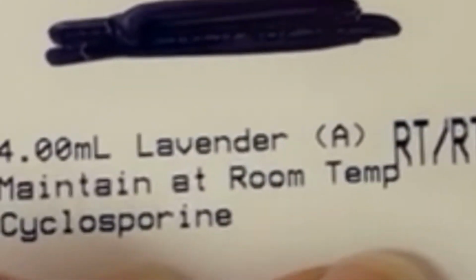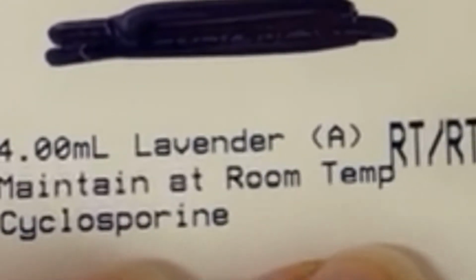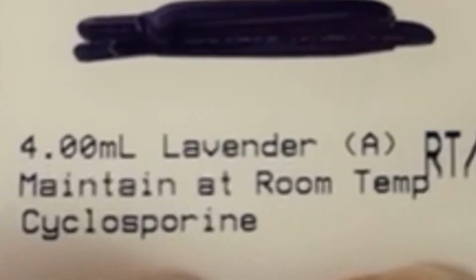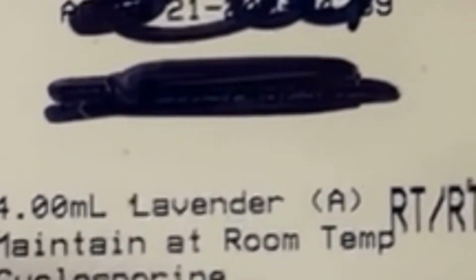So if you guys have labels that tell you what tube the test goes into and what the process is, then you lucked out, because it just made it a whole lot easier for you guys to figure out the tubes that the test could go into.